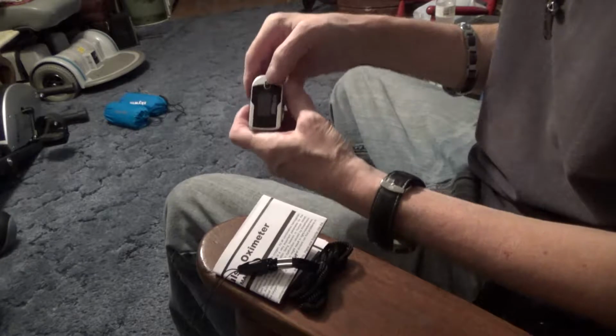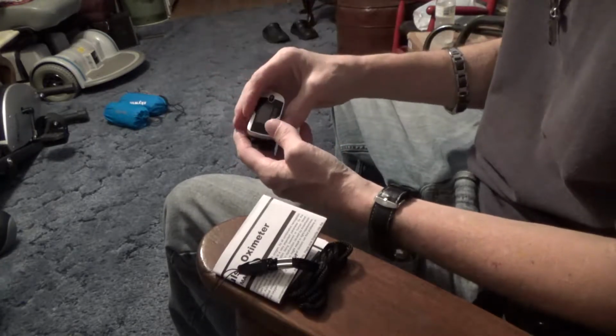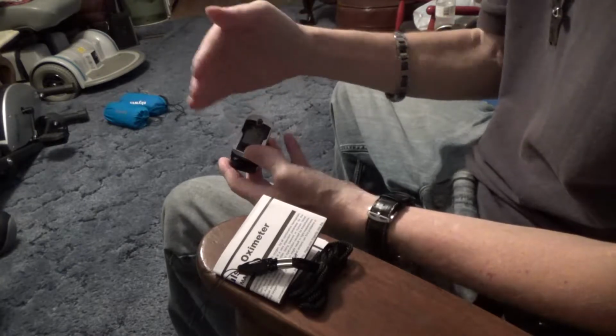If you hold this down, you can adjust the brightness level. I believe it's on 4, which is the default. Seems pretty bright to me. And then once it's on, if you push the power button, you can cycle through different modes for different views.